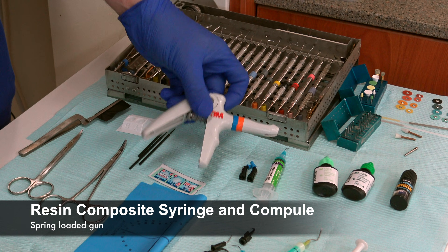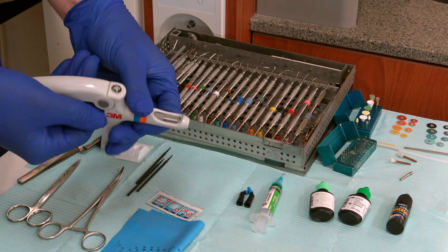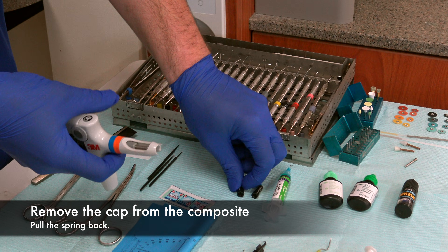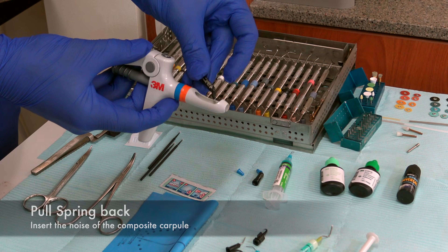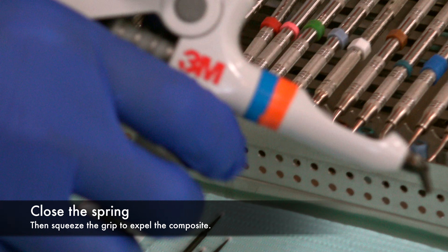We have Kerr brushes that can be used to cover the tooth with those materials or move composite. And then we have our composite gun. This is a standard composite gun that has a spring-loaded mechanism where the spring can come in and out. The composite comes in these little carpules. You pop the cap off, pull the spring back, insert the nose of the composite carpule first into the gun, close the spring, and then you're ready to go.